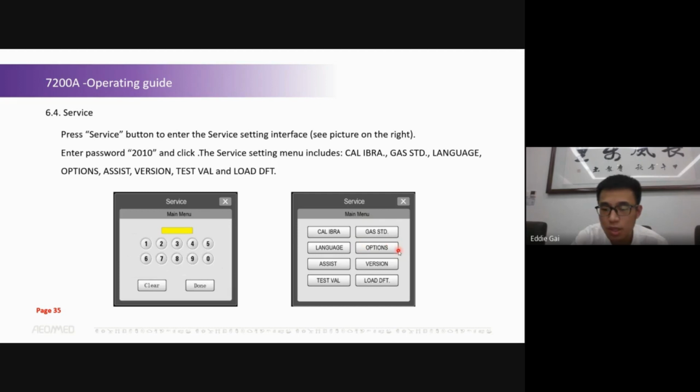You need to get in communication with us, and we will give you the code of the machine to add the function. And check the software, test the voltage and load.